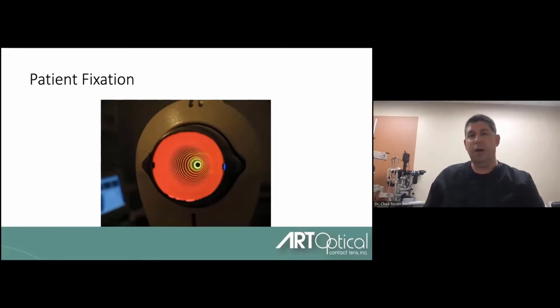So I would say multiple times a semester, we'll be sitting in our attending room and the student will come to us and say, the topographer is broken, it won't take an image, the beam's just kind of bouncing around. And we usually say, we'll just have the patient open their eye a little bit more, that'll solve it. And they say, well, I already did that. And it's like, well, try again, open a little bit more. And sure enough, once they get the patient's lids open, the image works just fine. So really important point is to make sure the patient has their eye wide open. We're going to get the most amount of data. It's going to make it the most accurate to be able to put into that calculator that Dr. Morgan just shared with us.